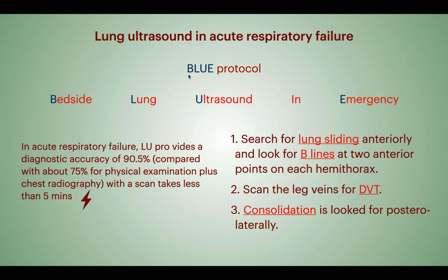Leave the abnormal signs away for now. You will get it with time. And then, after mastering the normal lung ultrasound, try to check for abnormal signs. If you have a patient with a very clear chest X-ray for pneumonia, try to catch the consolidation by ultrasound. Train yourself to do so.